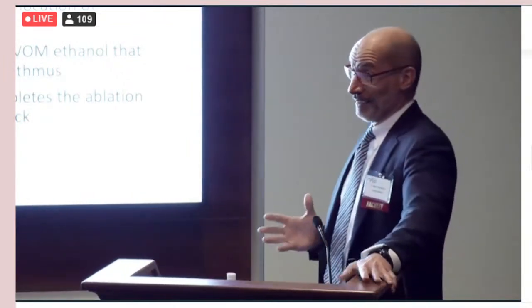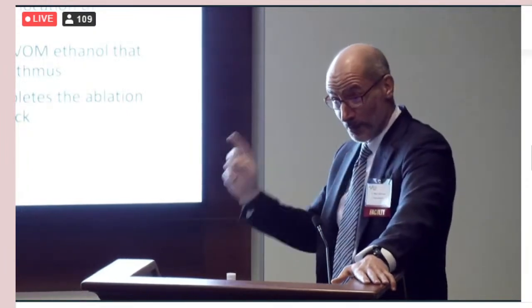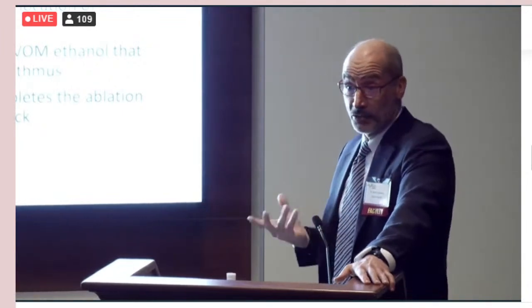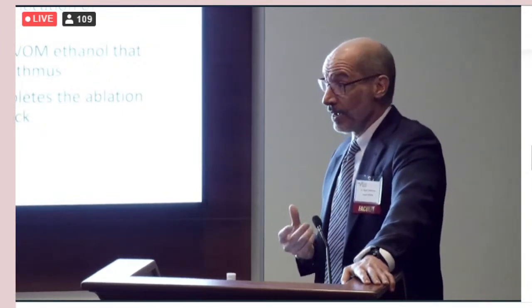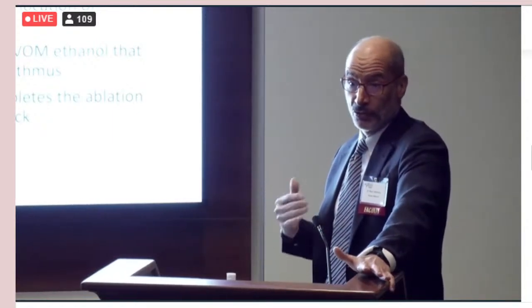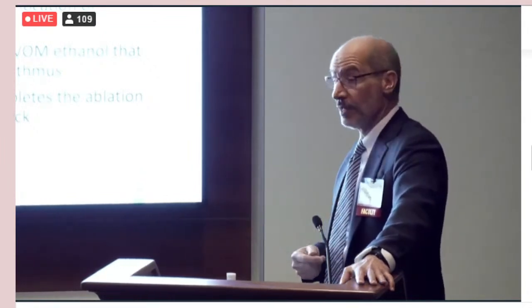So remember, the IRB had approved one case, and I had to give them a report before they would approve the second case. So I gave it very slowly. And the interesting thing is that after you give it slowly and you let it sit there, it blows up the capillaries. So those collateral communications are not present after the first alcohol.